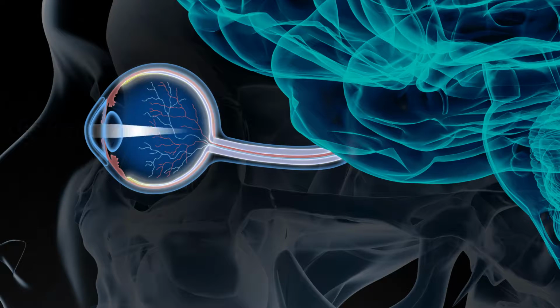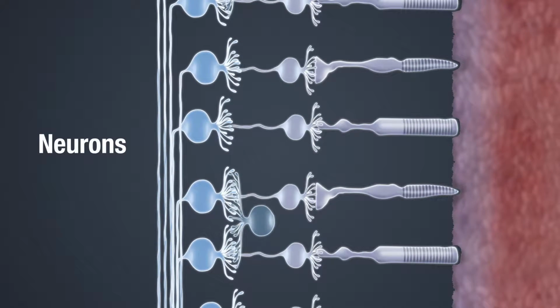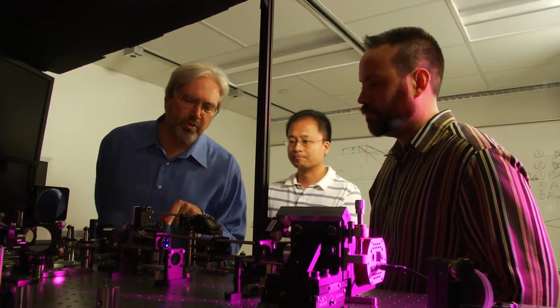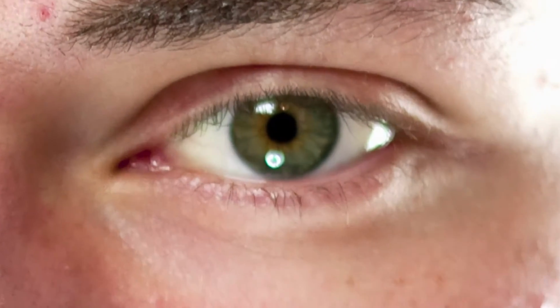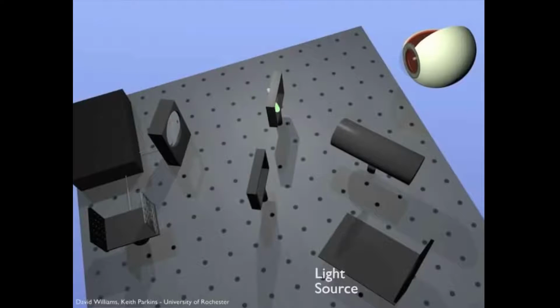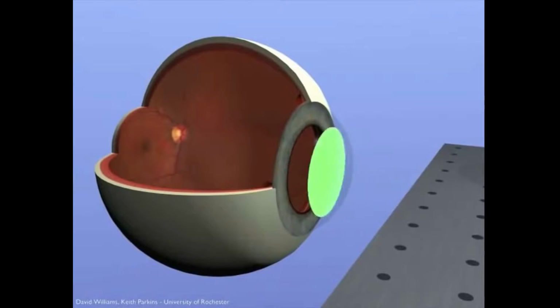There is much more to see inside the retina and optic nerve, including details about individual neurons, their health, and their function. Several ongoing projects federally funded through the NEI Audacious Goals initiative have recently begun to develop new imaging technologies to do just that. One challenge to viewing the retina is that light becomes distorted as it passes through the front of the eye. That distortion increases at higher magnifications. The solution is an approach called adaptive optics, which measures these distortions and corrects them.